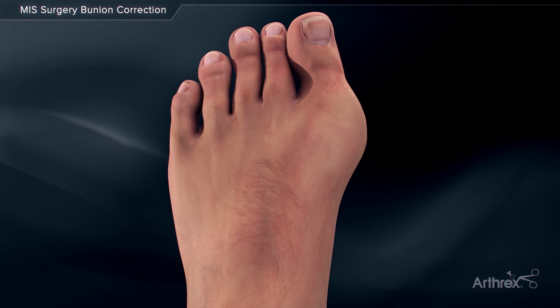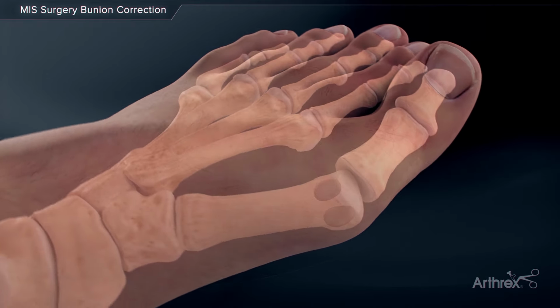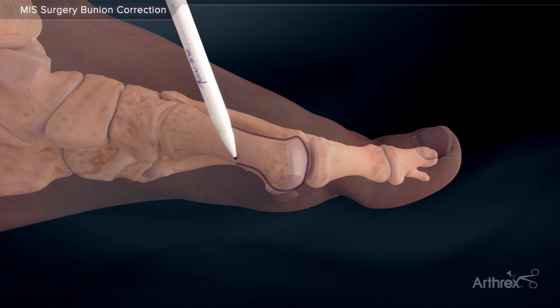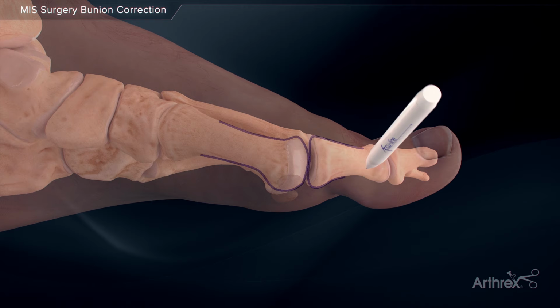Arthrex presents a minimally invasive bunion correction to correct mild to moderate bunion deformities. First, palpate or outline the dorsal and plantar aspects of the first metatarsal and hallux. It can also be helpful to mark out the bisection of the shaft on the metatarsal neck.